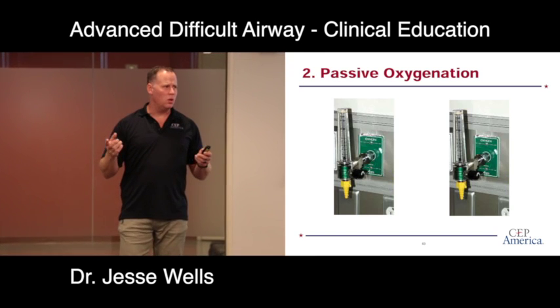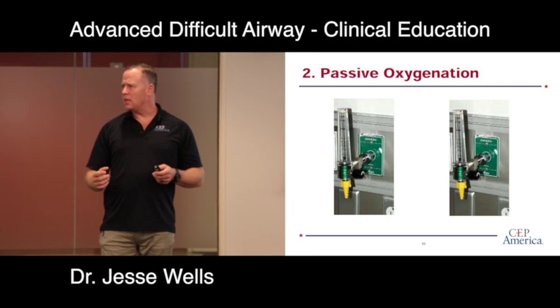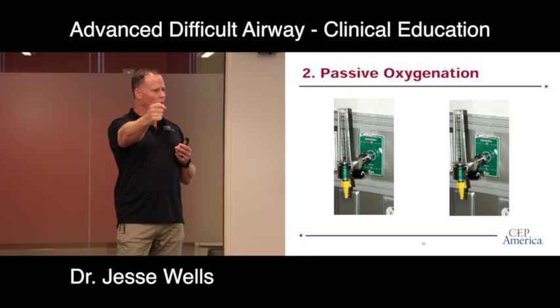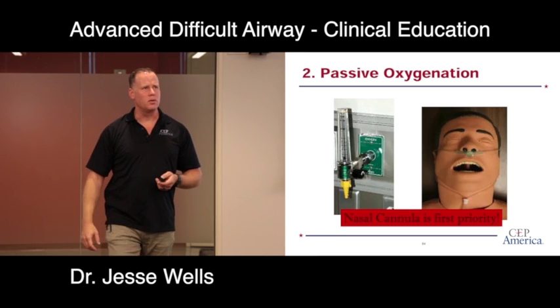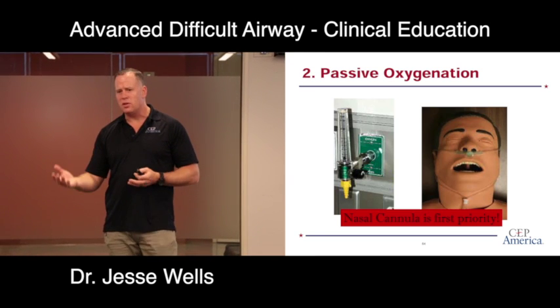How many of you have two oxygen trees in all of your ED rooms? Not many of you, so about a third. One nice thing, and I'll show this in the last slide, is they make a double tree that plugs into one wall outlet. So you don't have to remodel your ED, you just have to buy these double trees that will allow you to run two.